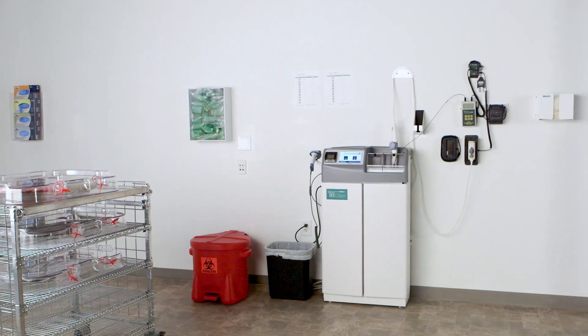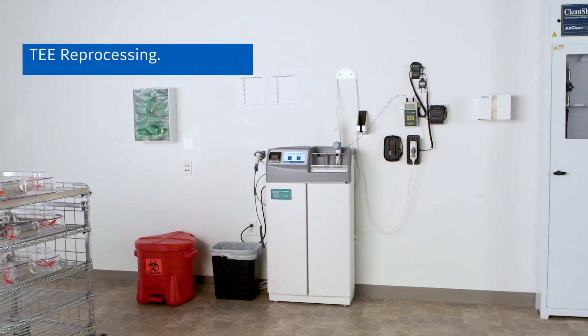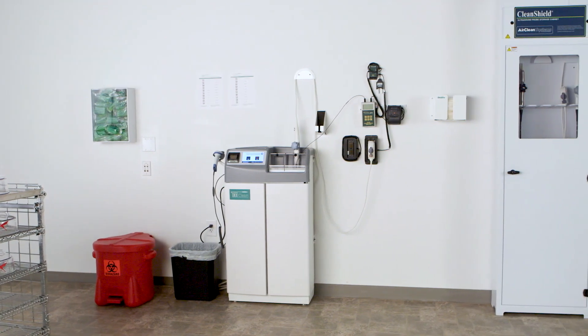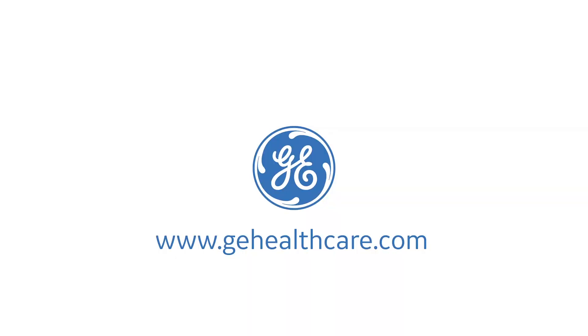GE Healthcare offers a complete portfolio of products to assist you in the entire TEE probe reprocessing from one exam to the next, including bedside cleaning, cleaning and disinfection, transportation, and storage. To learn more about GE's TEE probe care solutions, visit gehealthcare.com.